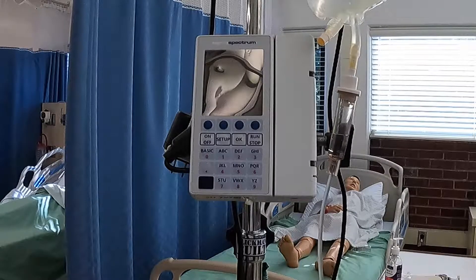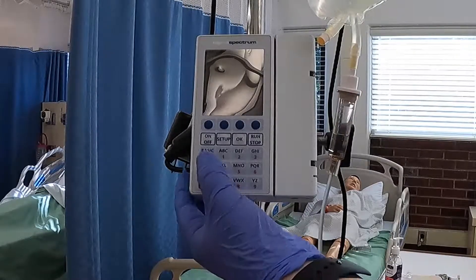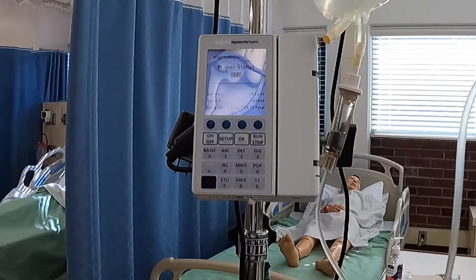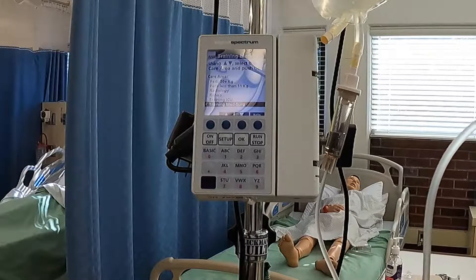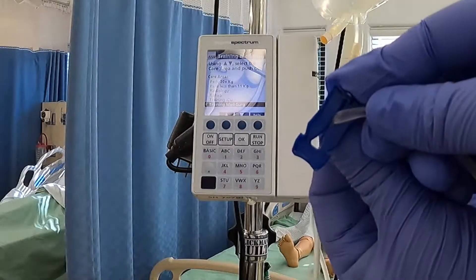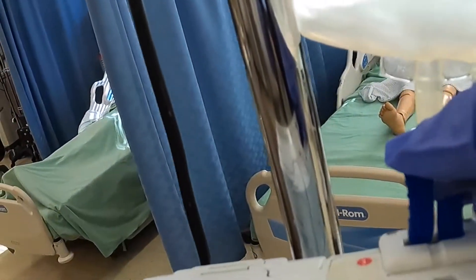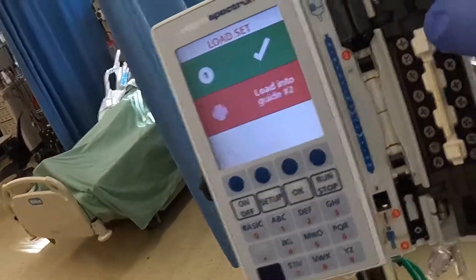Now I'm going to program this pump to the correct rate for our patient. The first thing you're going to want to do is hit the on button and it's going to load up. Then you have your little blue key, which I made reference to when I was showing how to prime the tubing. You're going to push it into the off position like so, and then stick it right in here, which will be the key — it'll open this area.